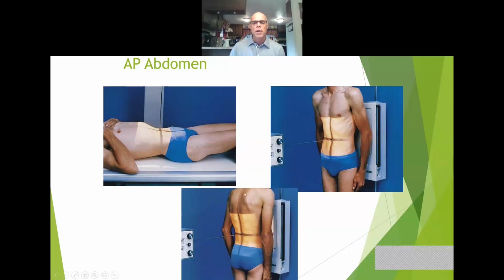Spinous processes come off of the vertebral body. Line it up perfectly there, and again, you're going to find the soft spot, which is going to be at the iliac crest. It says, for the supine iliac crest, ensure that the pubic symphysis is included. So again, looking at this person right here, right there is probably at the base or the upper margin of the pubic symphysis.